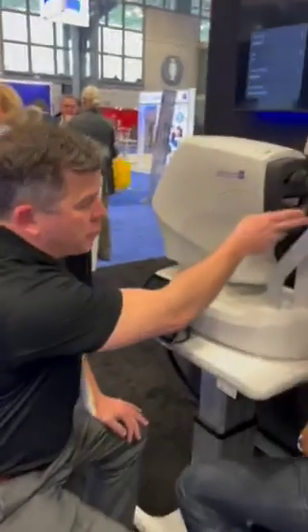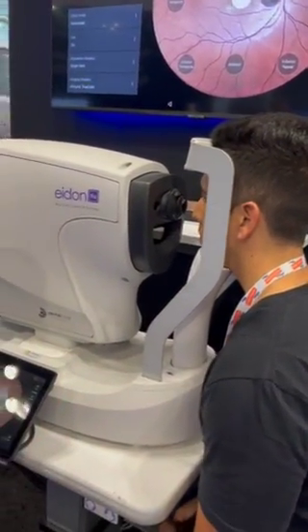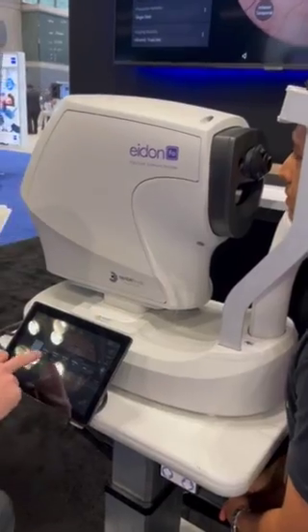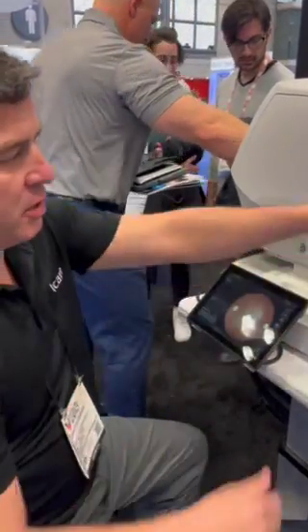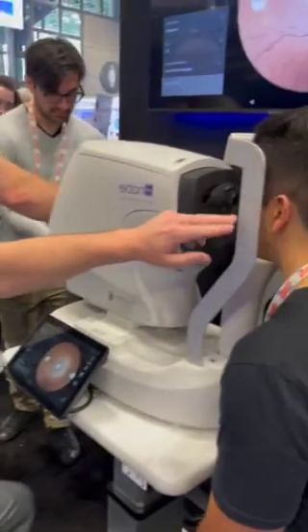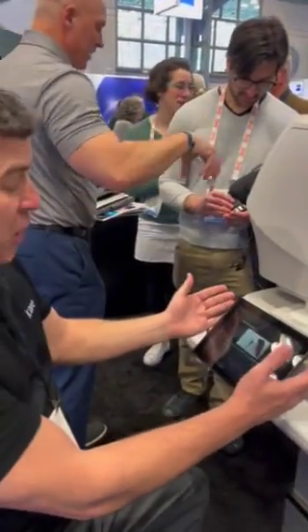All right, Chris. So we can have you put your chin on the chin rest, your forehead pressed against there. We're going to do the three image mosaic — our smart mosaic, horizontal. You get the patient in the chair here with their eye lined up right here, their forehead against the forehead rest, and the technician hits play.